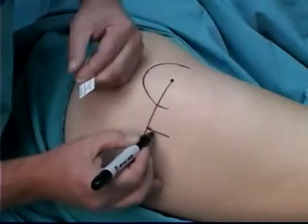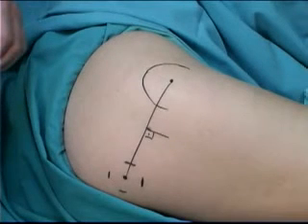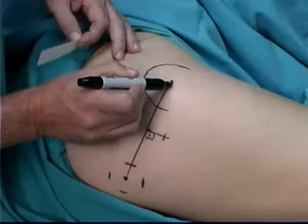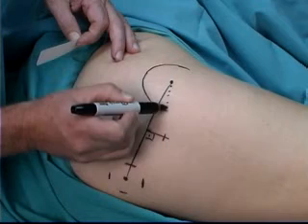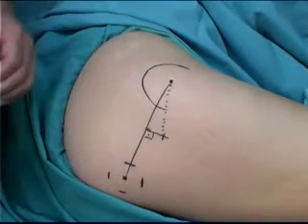Now draw a midline perpendicular to this line. This line indicates the position of the sciatic nerve, and the dotted line indicates the intended path of the catheter should a catheter be indicated.